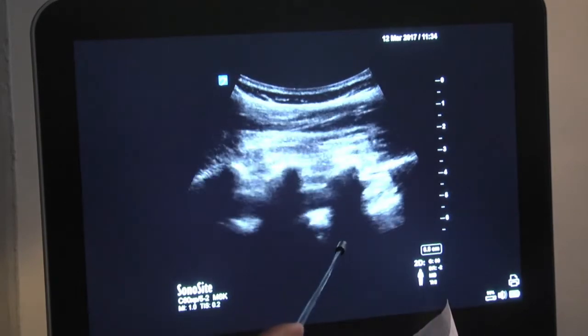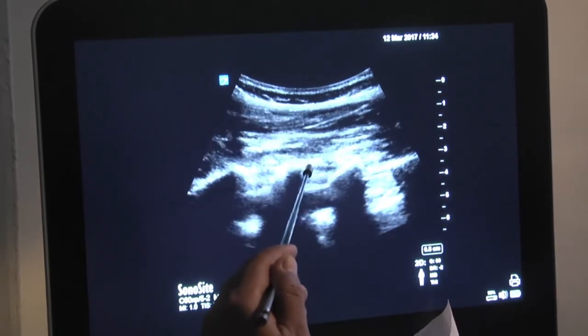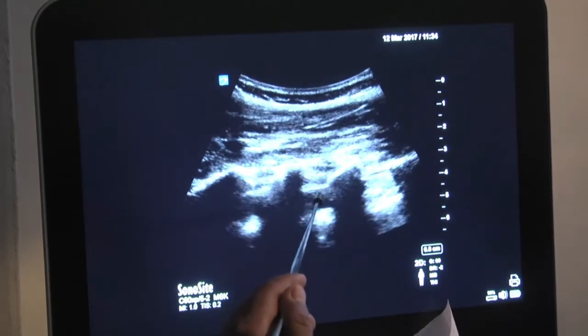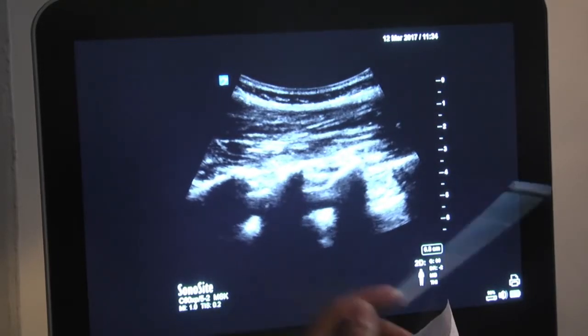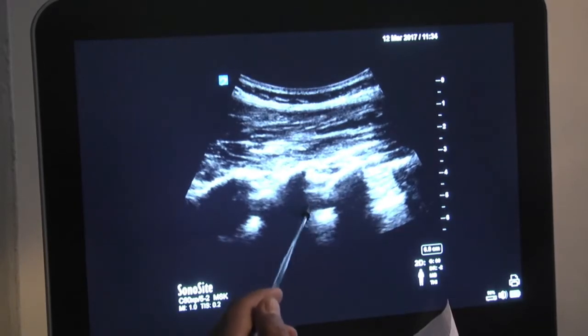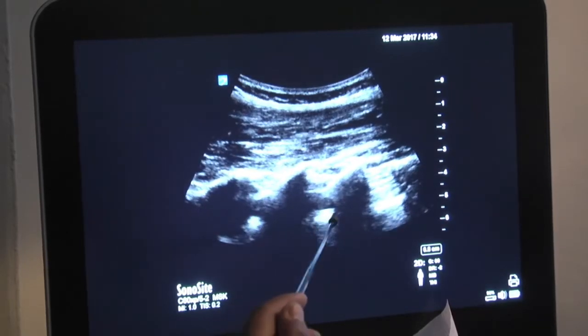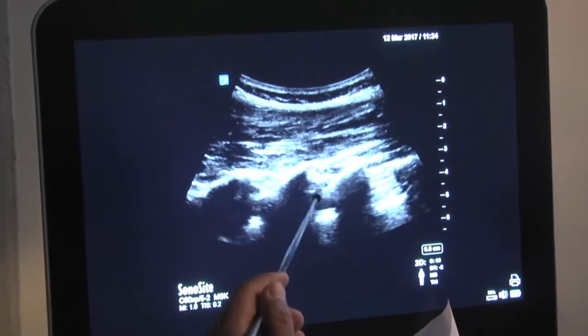So what you see here is, this is the muscle, this is the ligamentum flavum, this is the posterior dura, this is the epidural space here. You can see a few millimeters wide. The hypoechoic space is filled with fat, so it'll appear black, okay? This is the thecal sac with the anechoic fluid. This is the anterior complex. Again, it's telling you that this is a wide space.